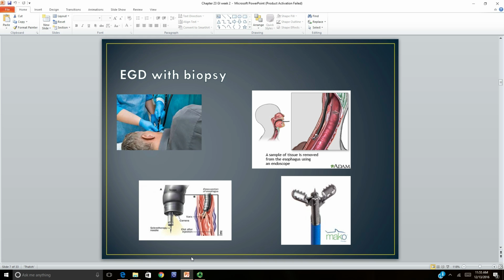If biopsies are taken, the scrub passes items needed for the biopsy to the surgeon. The biopsy instrument is inserted through an instrument port on the camera. Care should be taken when receiving the specimen. The tip of the biopsy retriever is usually swished in water or saline.